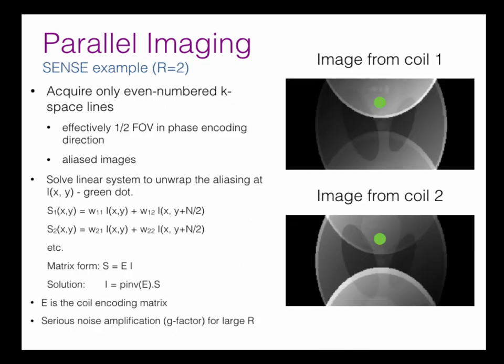What that looks like is that we now no longer have enough k_y, y-direction field of view to fully contain our image. What happens is the image wraps around, it aliases back into our field of view. In the middle we do a good job, but at the top, where the image goes off the top, it actually comes back on at the bottom because it wraps around, and where it's missing at the bottom, it comes back on at the top.